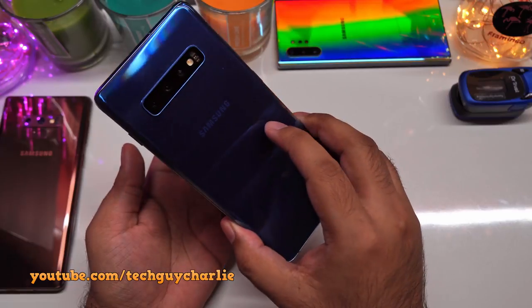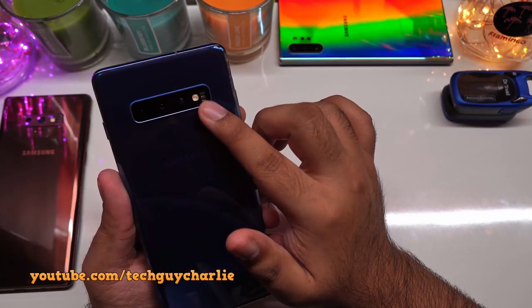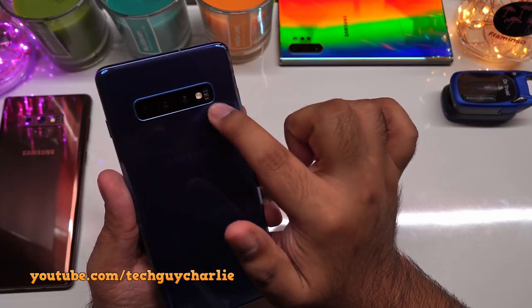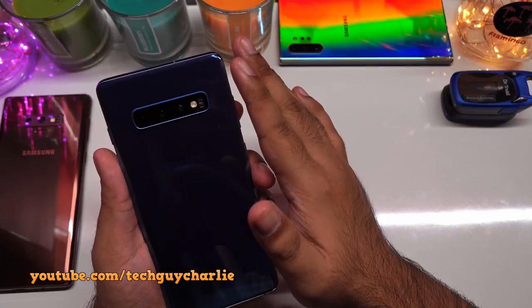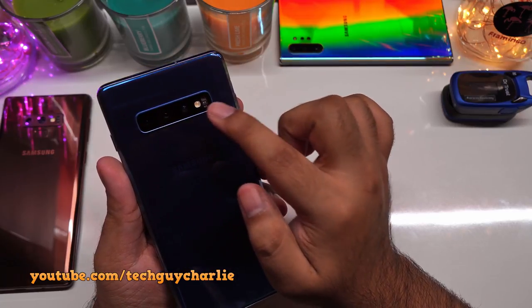This is the Samsung Galaxy S10, and here is the pulse oximeter — a dedicated sensor on the phone, not the camera. Starting from the Galaxy Note 4, all Samsung flagships up to the Galaxy S10 have the pulse oximeter built in.